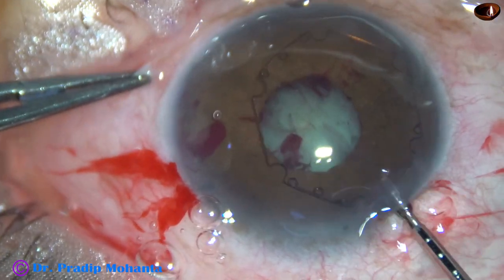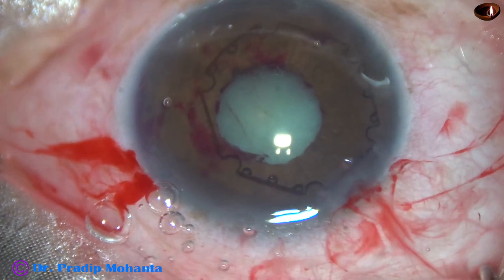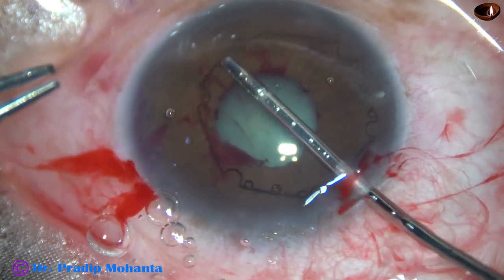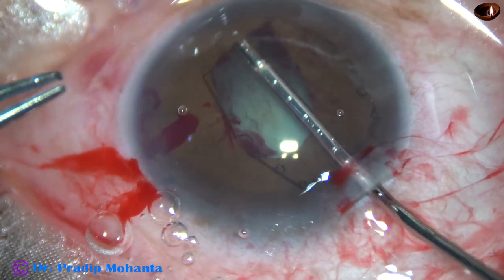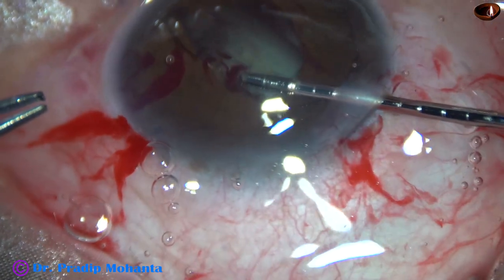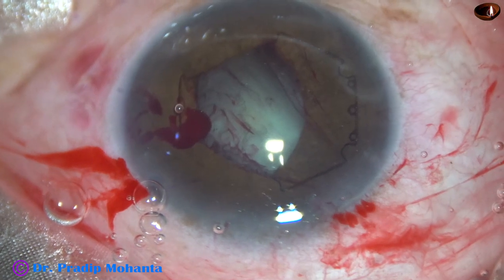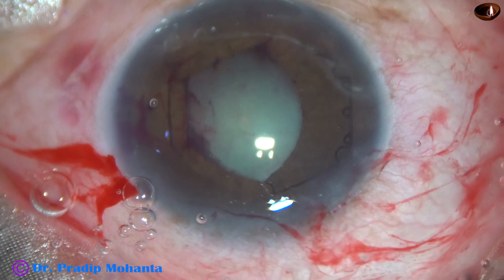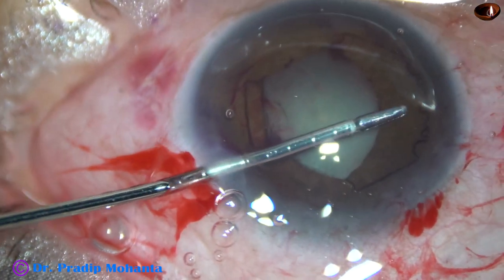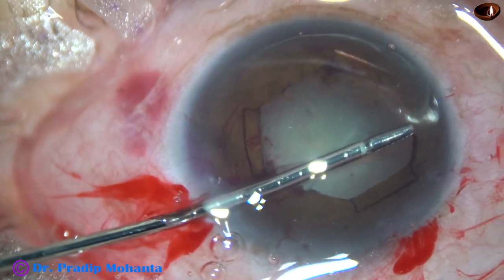Now see what has happened — as I am trying to introduce the B-hex, it got stuck in the main wound, the trailing part. So I have to push it inside. And then I am going to tuck the leading flange at 5 o'clock, centered at 5 o'clock. And then I hold the middle tab which is centered at 1 o'clock. These two flanges have been tucked under the iris. Some more visco — the anterior chamber is really shallow. But this device, the B-hex pupillary expansion device, can be applied in a very shallow anterior chamber. And this is the third flange — it is tucked.